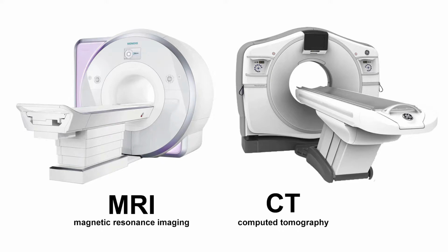Another difference is that MRI makes loud knocking sounds, no matter what strength MRI it is. The open ones are a little less loud than the closed ones, but they all have noise, versus the CAT scan, which is quiet and faster.